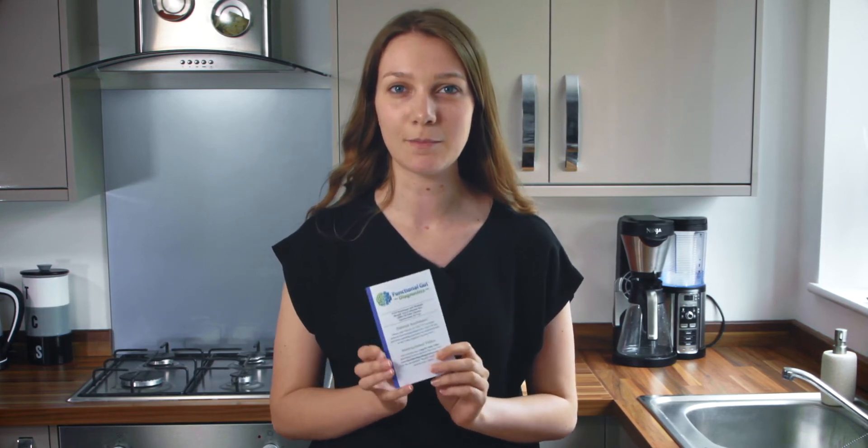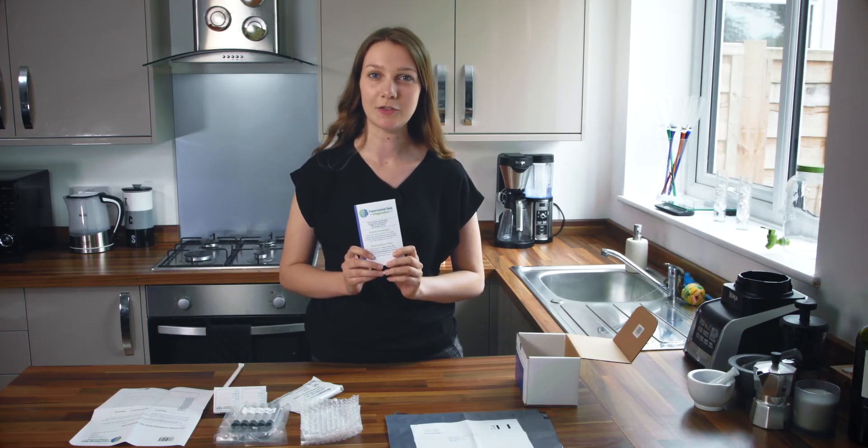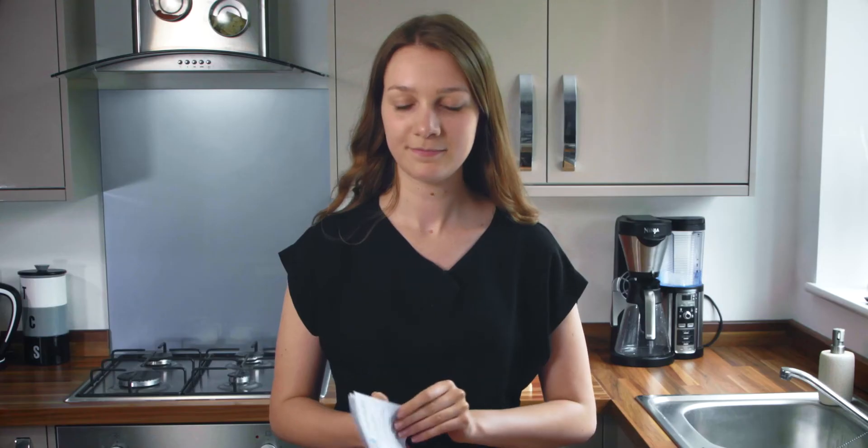Before you begin your postal breath test make sure to read the enclosed instructional booklet carefully. This booklet includes details of preparation you need to follow before your test. By following this preparation exactly you can ensure that your results will be most accurate. For four weeks prior to your test you should not take any antibiotics. For one week prior to your test you should not take any laxatives or pro-motility agents, but you may continue with any other essential medication.